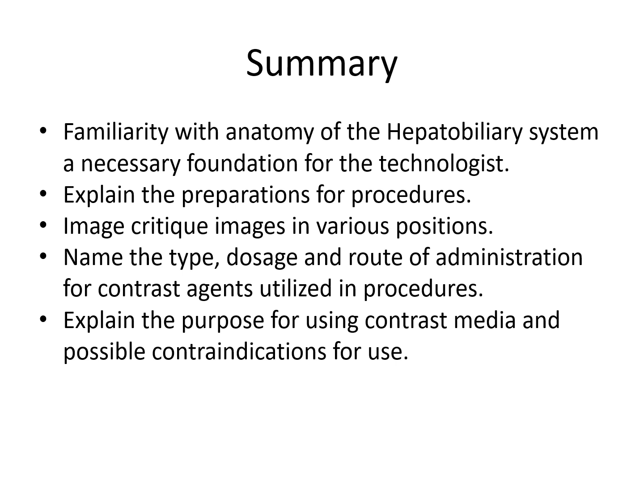Okay, and why we're using contrast is so we can see the biliary system and rule out the presence of either gallstones or stenosis of the common bile duct, and keeping the whole point is patency of the common bile duct so the patient can pass bile in accordance with normal physiological process.